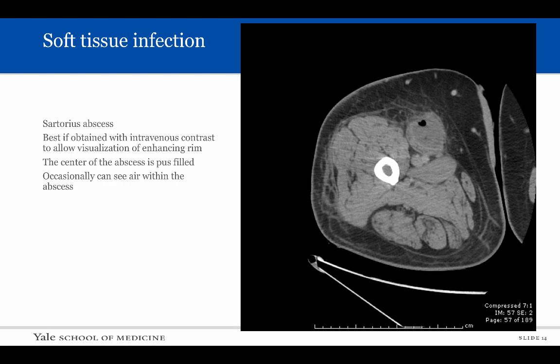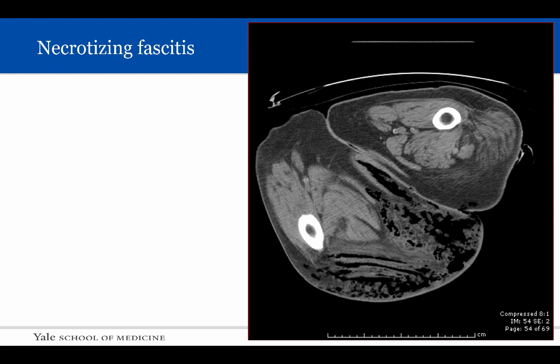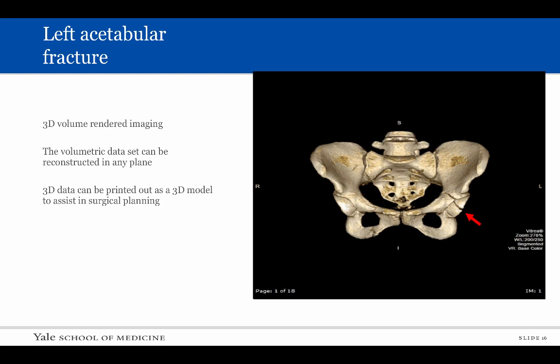CT scan imaging can be helpful in evaluating soft tissue infection. The sensitivity and specificity is improved when intravenous contrast is used. This patient presented with a sartorius abscess, which on imaging has an enhancing brighter rim with central fluid attenuation and a small locule of air. This patient had a more serious infection known as necrotizing fasciitis in which there is extensive subcutaneous gas throughout the posterior thigh. Note that the black attenuation of the gas is the same as the air external to the patient.